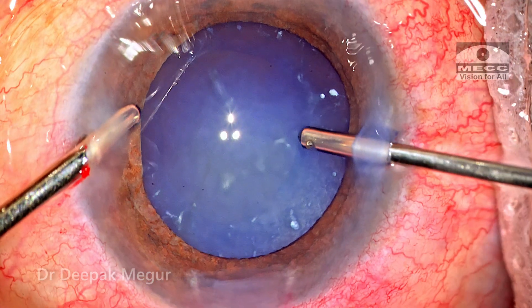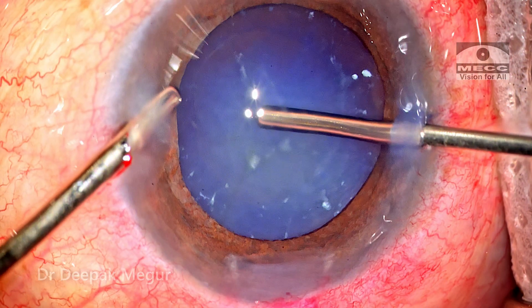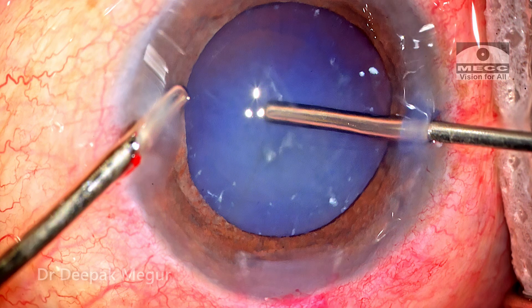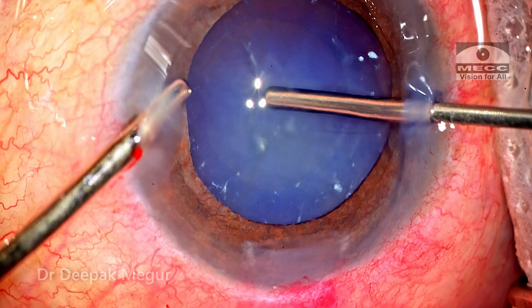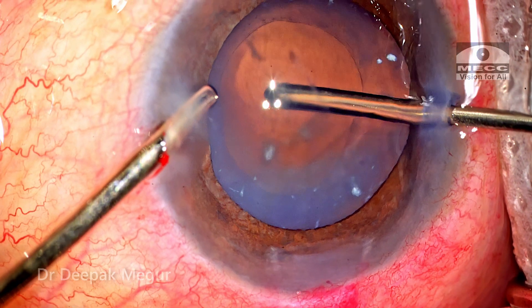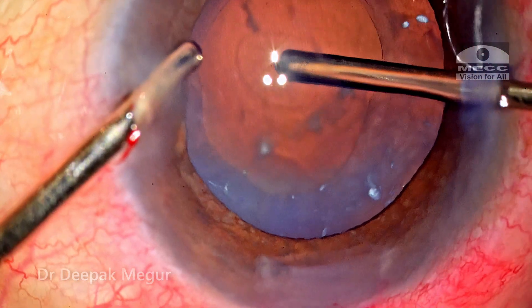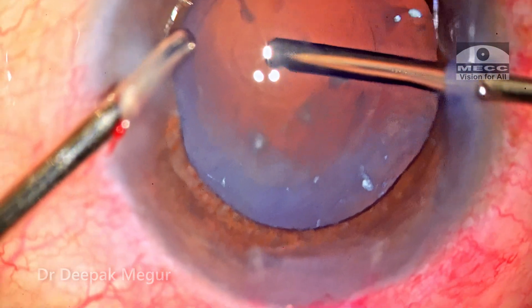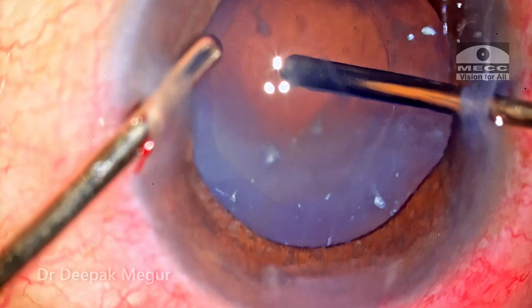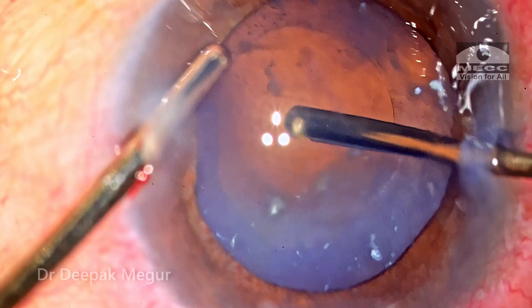The vitrector is introduced with its bevel facing posteriorly towards the posterior capsule. As the foot pedal is pressed, irrigation and then vacuum are set in. I engage the capsule and then cutting is begun. The sudden appearance of the red glow indicates that perforation of the posterior capsule is successful and the underlying cortex has been absorbed or displaced. This confirms that we have an opening. The critical technical aspect now is to ensure that the posterior capsule opening does not enlarge suddenly or extend towards the equator.